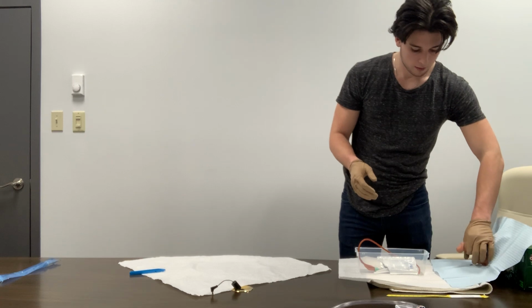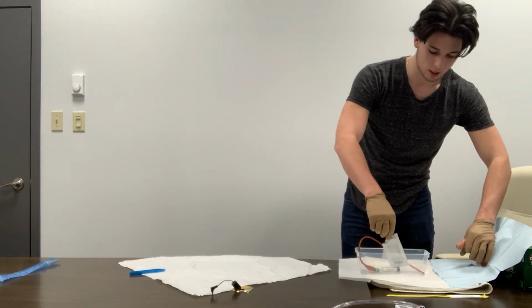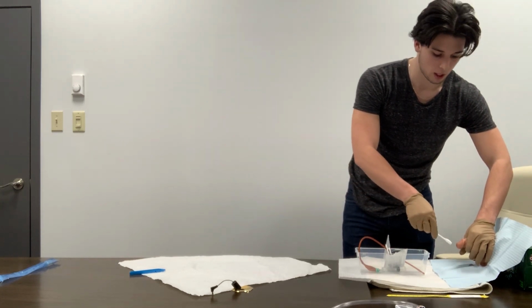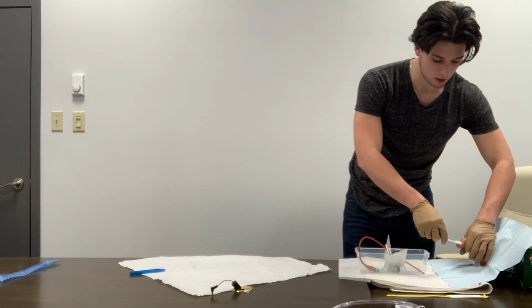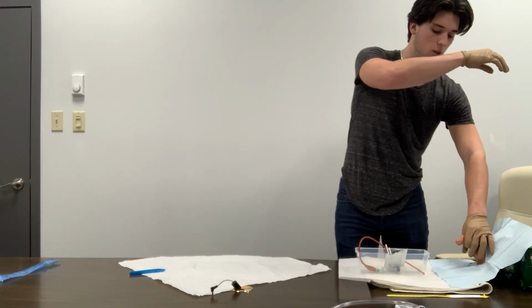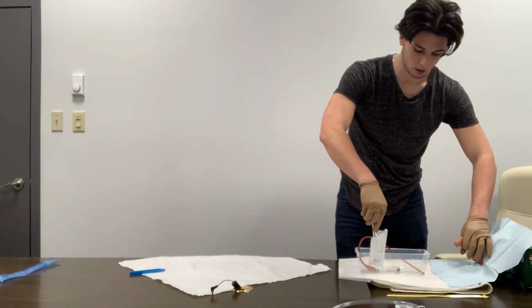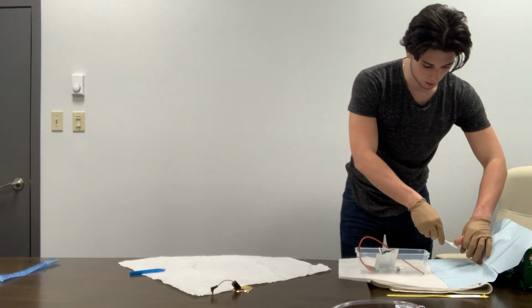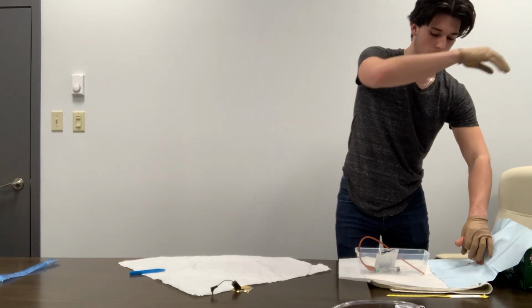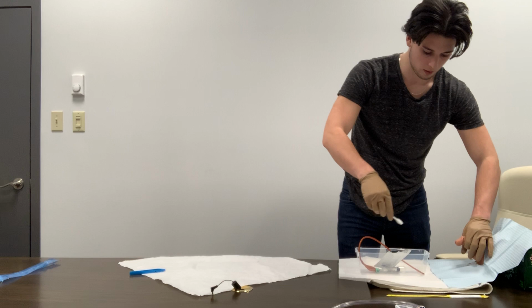And once I've grabbed this, I'm going to grab the povidone sticks with my other hand, which is considered still sterile. And I'm going to start cleaning. Now I'm going to start at the meatus and work down the glans to the base of the glans in a circular motion. So I'm going to work down, and then I'm going to throw out the povidone sticks. So I'm going to do a second one here. Again, starting from the meatus, working our way around. And we're going to do one more, we're going to do a third.